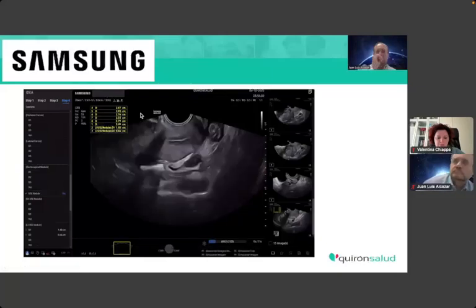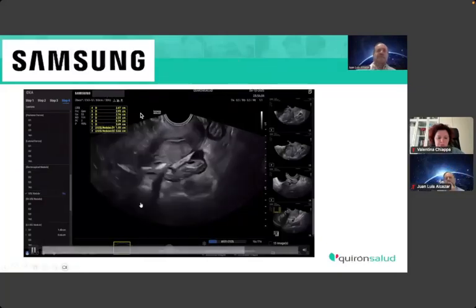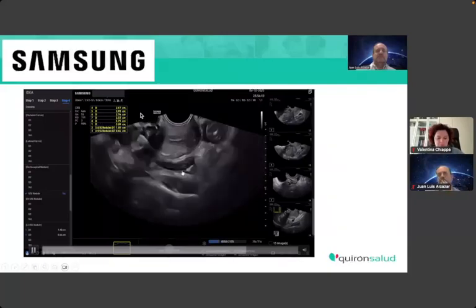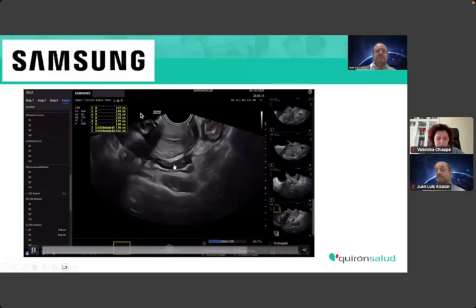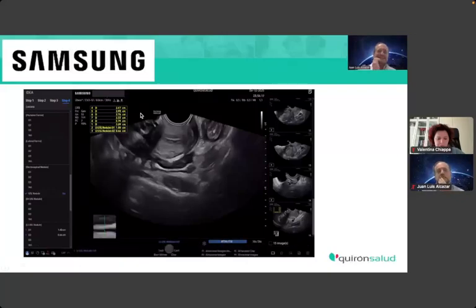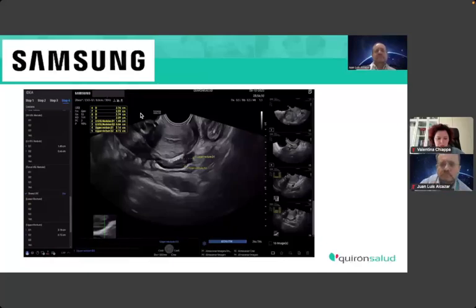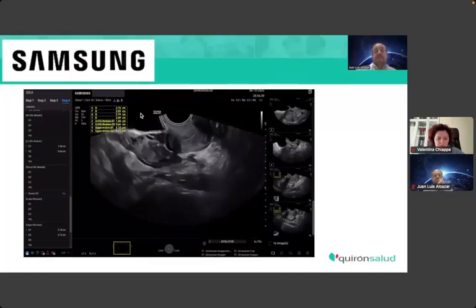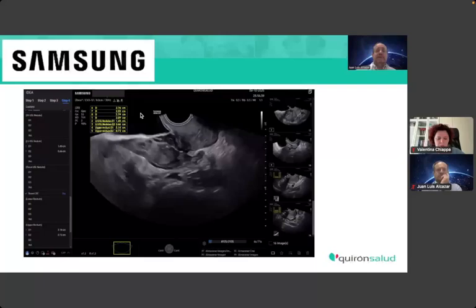You still look for another lesion in the posterior compartment, either in the bowel. Okay, we can see clearly that lesion in the bowel here, right there, and then you can measure it. This is the upper, so bowel deep endometriosis is okay, and then you go for the upper rectum, so you measure it. You have to scan the lower rectum, already scanned, and also the sigmoid.